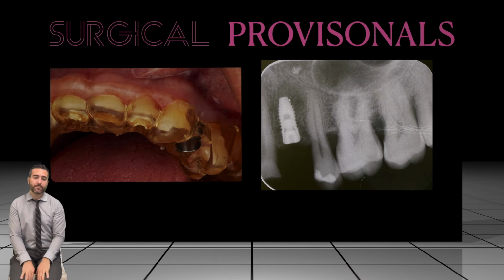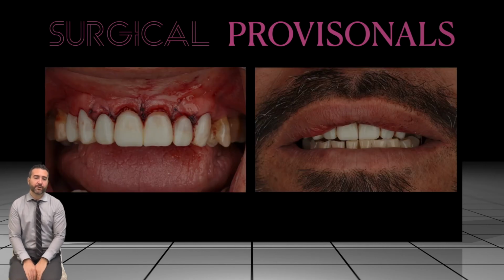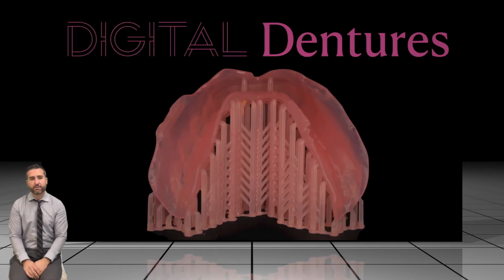And then we slide that implant in right there, and then we're going to have our 3D printed provisional here. And then we're going to go ahead and do our surgery, reline that provisional, and the patient's able to walk out with temps without having to worry about making temps after that surgery.